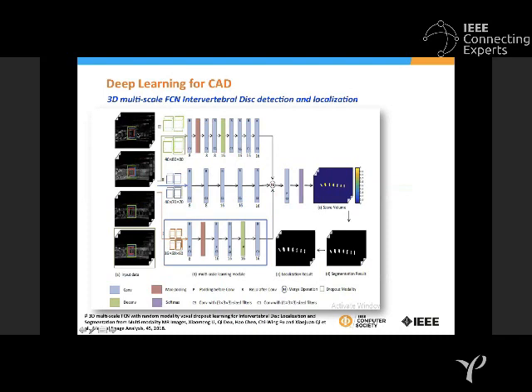Secondly, this is multi-scale, which means it works with different resolutions of the images. It works on low resolution features as well as high resolution features of the same image, and tries to extract patterns from the low, mid-level and high resolution, and then tries to merge these patterns.